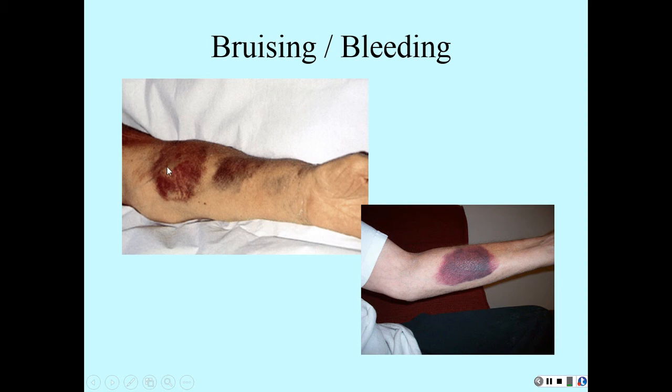You have to hold good pressure. If it is leaking at the site, just dress it, put gauze on it, continue to hold pressure. Change the dressing if you need to, and just elevate the extremity again. Elevate it up. You can put some ice on it.